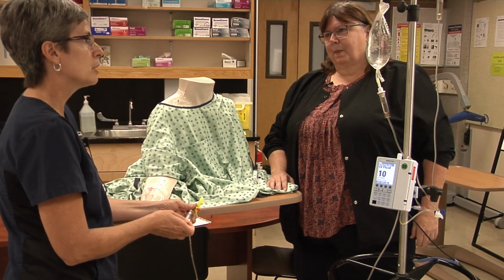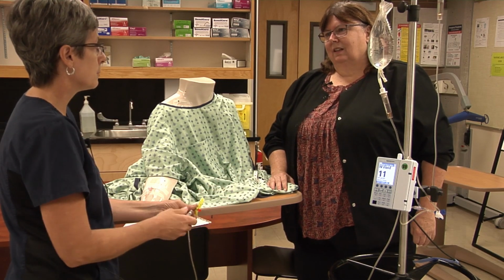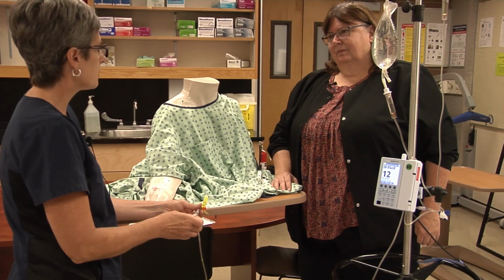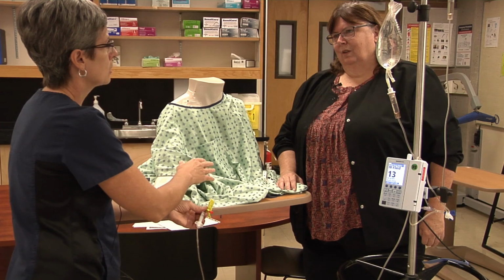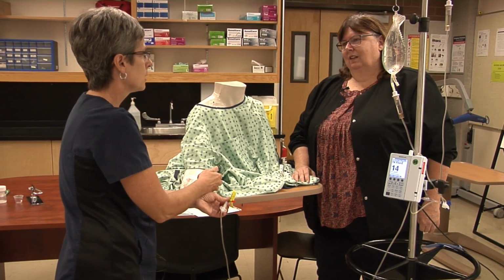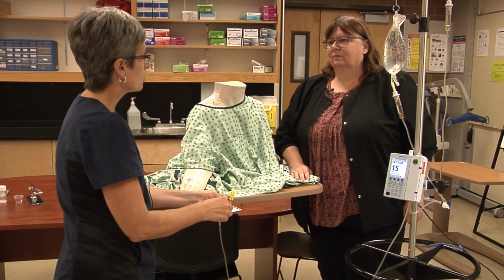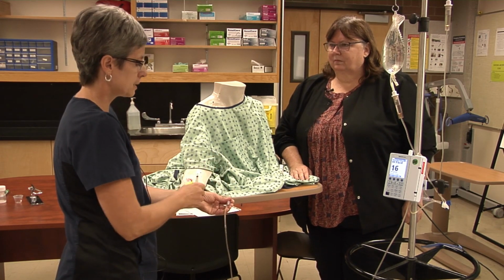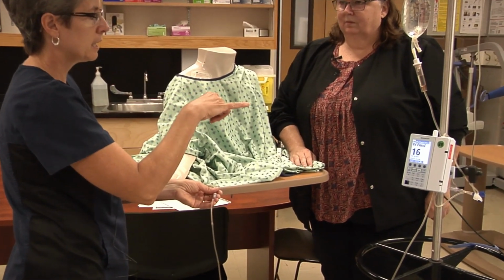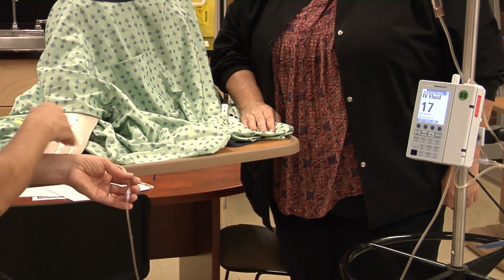If you're running your IV with gravity, you would just simply open it up and increase the rate. Always thinking about the patient, and is increasing the rate going to cause them any harm? That's right. So if they have a history of pulmonary edema, heart failure, renal failure, you have to be really careful with how much you are going to bolus them with. Okay, so our time has lapsed, the drug is in, I've disconnected, and now we still have 15 mLs that is going to bolus in and do our end flush.